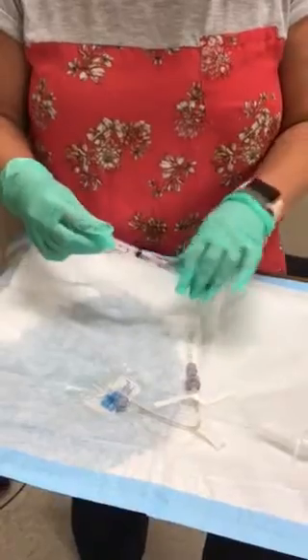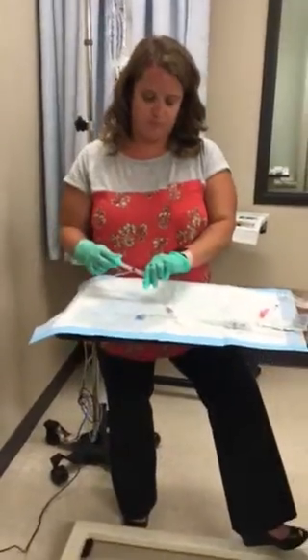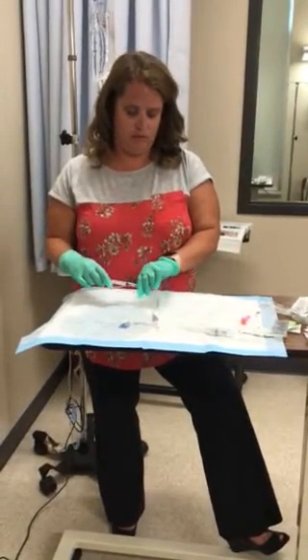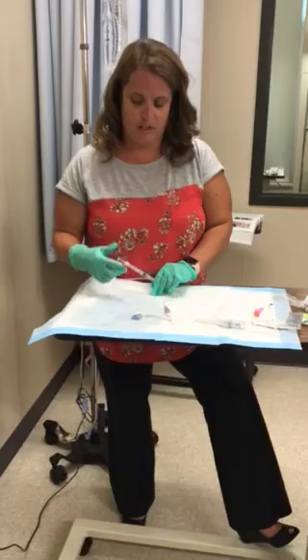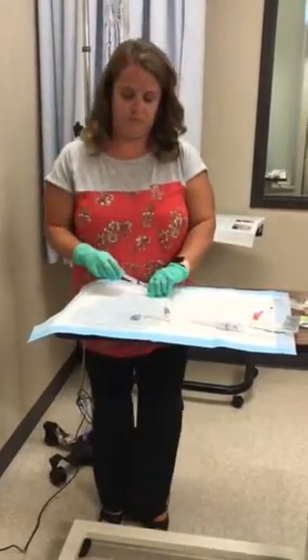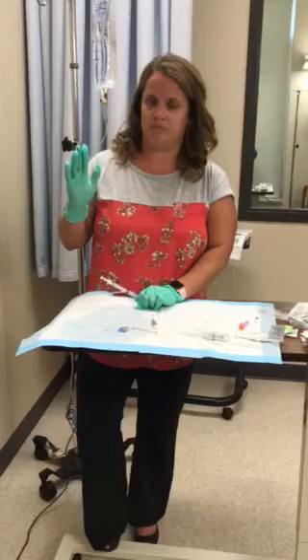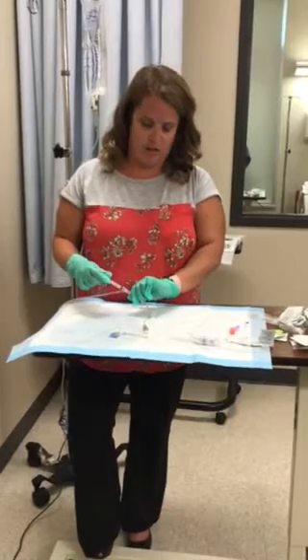As you're pushing, you just want to slowly talk to the patient — tell them what medicine you're giving, what side effects are possible, and answer any questions they have during their care here at the hospital. Make sure while you're giving this, you're going to assess the IV site for phlebitis and inflammation. If you don't see any of that, that's excellent. Some nurses don't always give medication using the seconds-per-line method, but it is the safest way to give medication as you practice as a nurse.